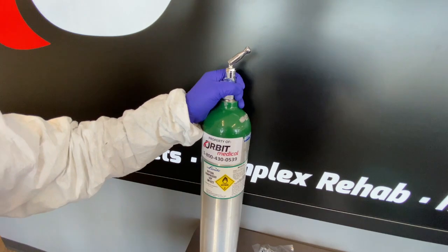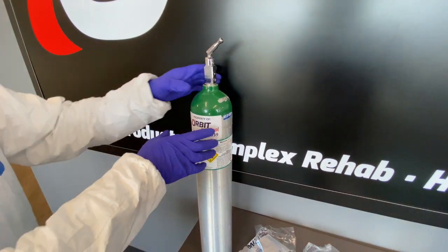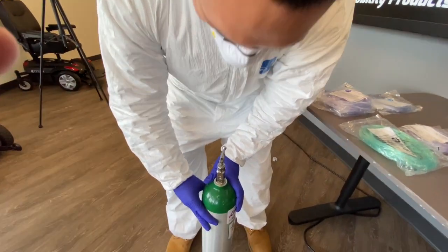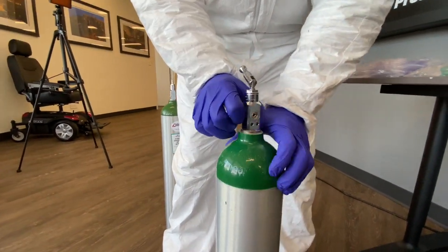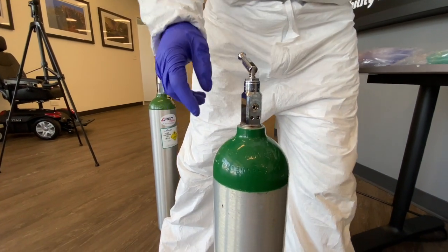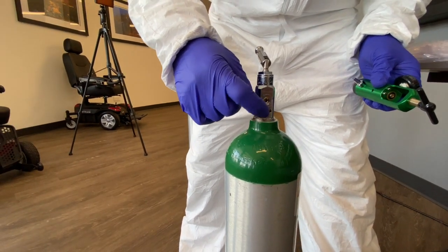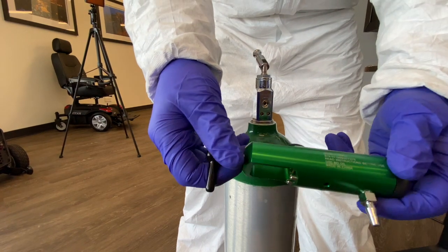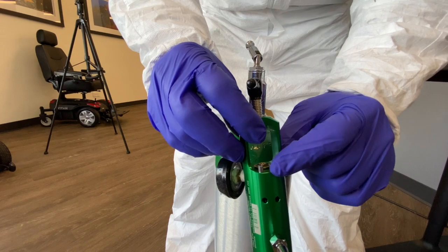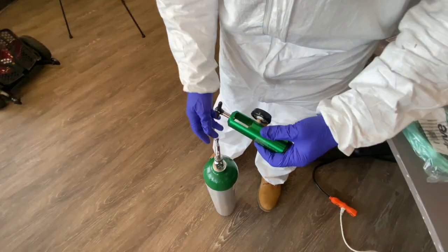This is called an e-tank — an emergency tank. It'll come with a plastic tab; for demonstration purposes I've already taken it off. It has four sections, and what I'm looking for is the interface where it's got the big hole and the two little ones underneath it. I'm going to grab my regulator and try to line up these two pegs into the small holes. I'll have the cameraman give you a bird's-eye view.